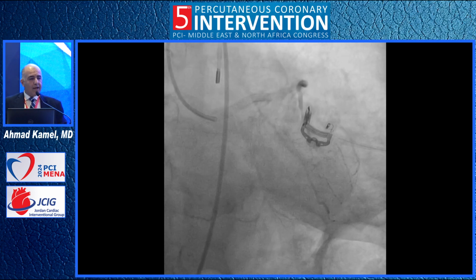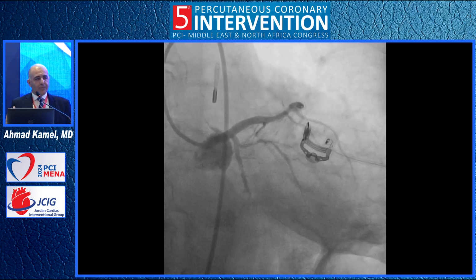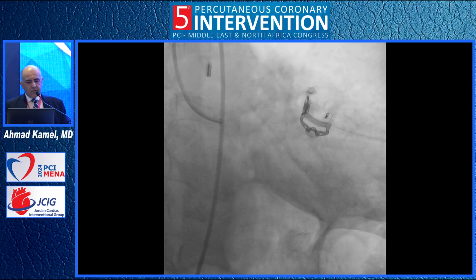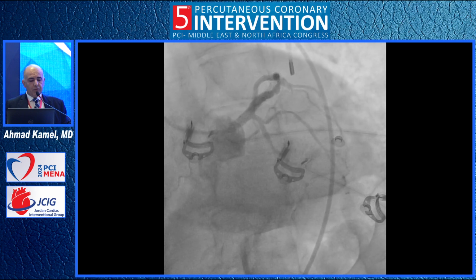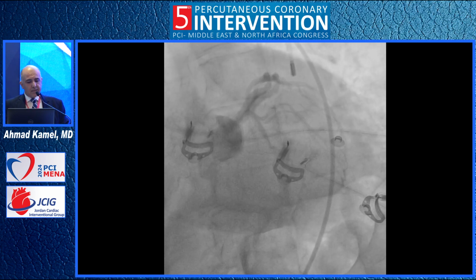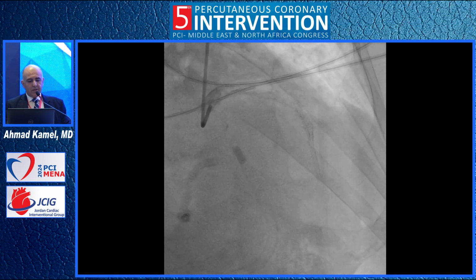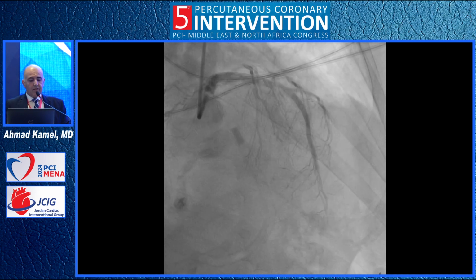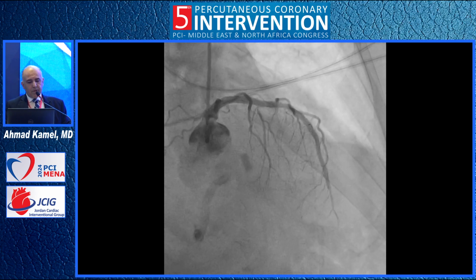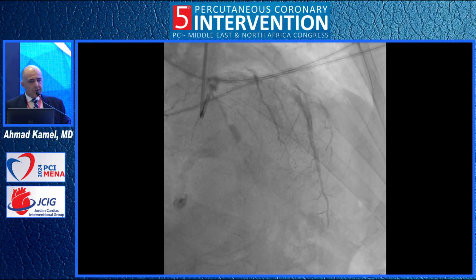The left main is okay. The type 1 perforation in the proximal LAD is now gone. No extravasation of the contrast. This is the spider view. As you can see, we now have the LCX. The LCX is okay. We have TIMI 3 flow in the LCX. And you can see the balloon pump. And this is a cranial view. We can see diagonals, septals. The patient has good blood pressure. The flow is better than before.